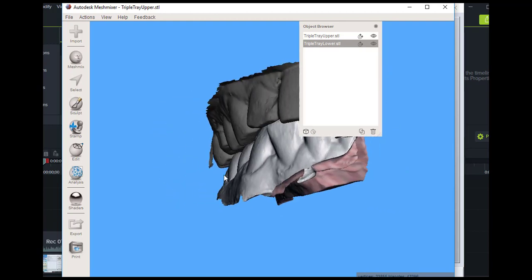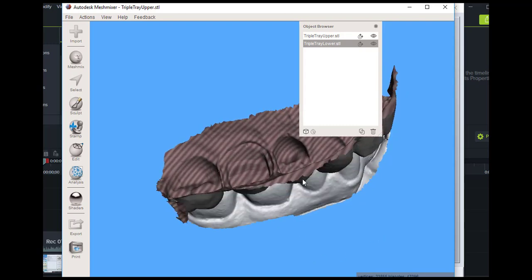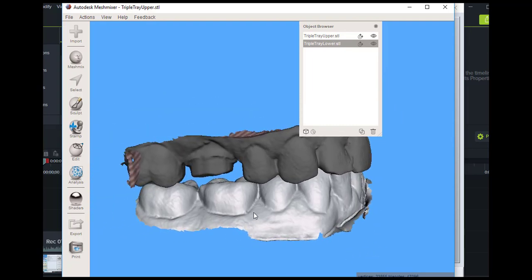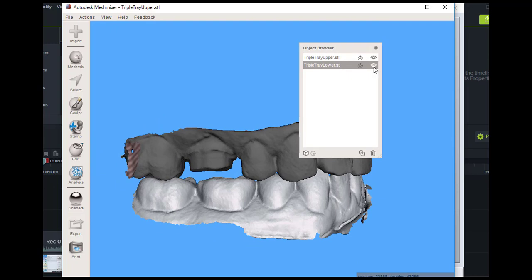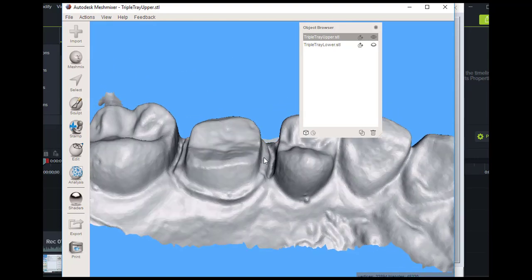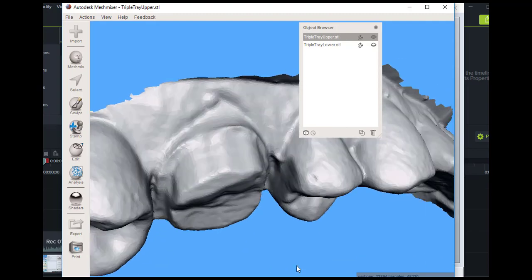Now you will notice that the bite looks a little bit strange. That is simply how this patient bit in the triple tray. And as with any triple tray, you need to make sure, first of all, that they are biting in their proper maximal intercuspation position. But let's just zoom in briefly and look at the maxillary impression, at the detail that we've achieved on the margin area of this impression. And you can see that this is nicely defined.